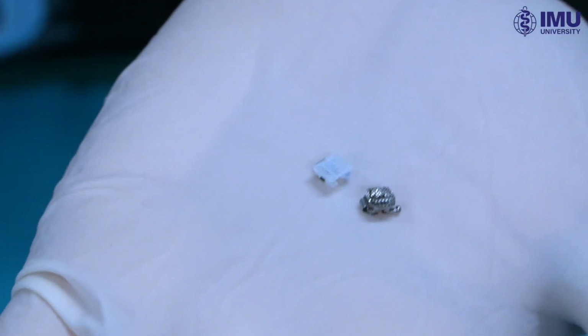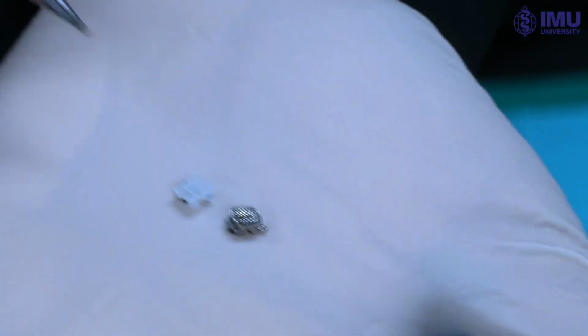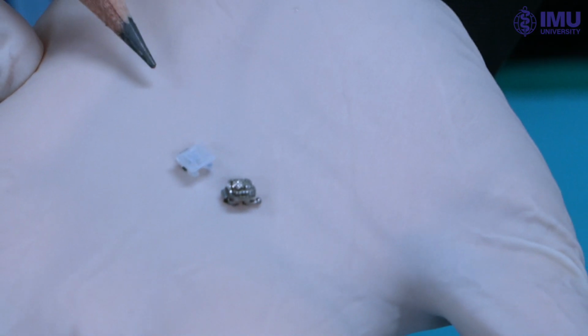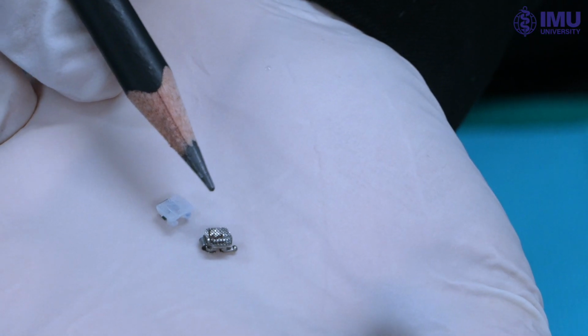Brackets are available as weldable or bondable brackets. We can see here bondable brackets. They are bonded directly over the tooth and it has a meshwork under the surface.